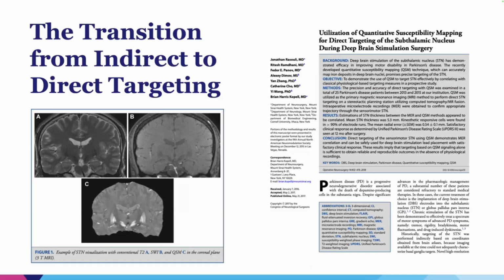And, when you're a surgeon, you get used to doing something a certain way. There's this energy of activation that sort of prevails to change and evolve, but you're either evolving or you're dying, and that's my philosophy. And so what we did was we looked at a number of patients, looking at concordance of microelectrode recording, best targeting versus T2 versus QSM. And once I got essentially comfortable with this, I had much more confidence in really moving forward with QSM direct targeting.